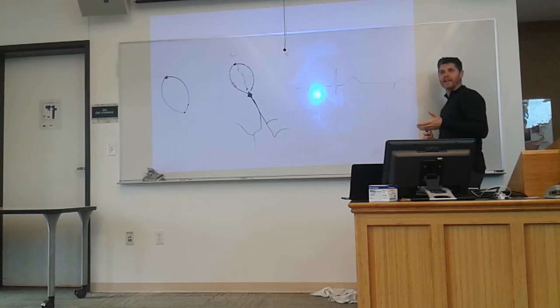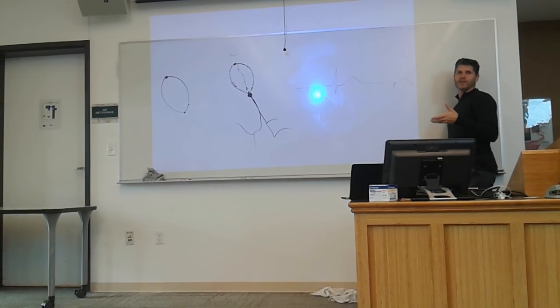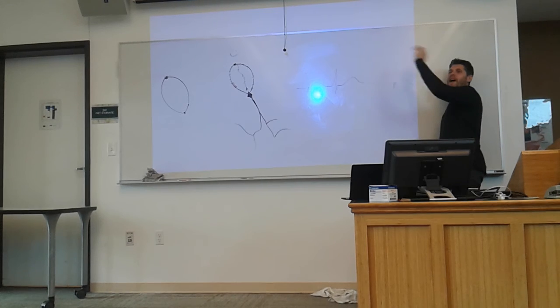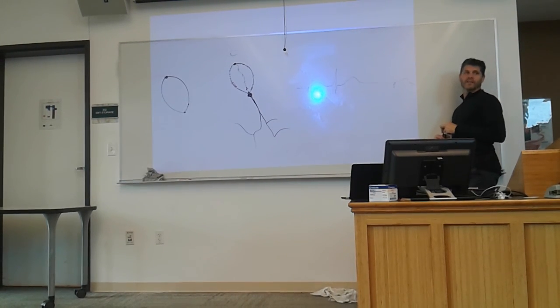So if there is no delay, and I hate using that word because I don't want you to think delay in the same sense of the AV node, pause. But if there is no time between when the SA node fires and when it is firing again, then what do we see on the EKG? Constant P waves. Sawtooth P waves. You'd be seeing constant P waves.